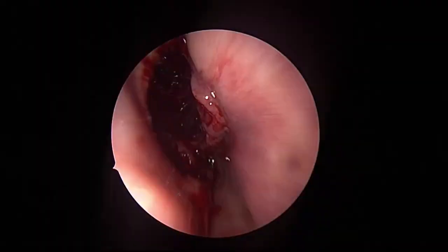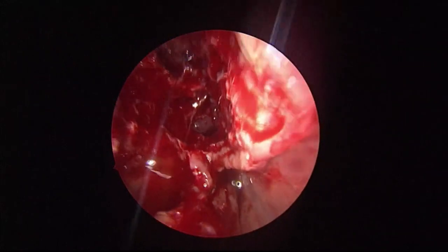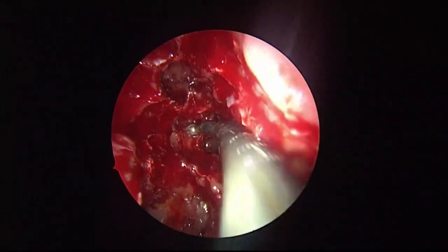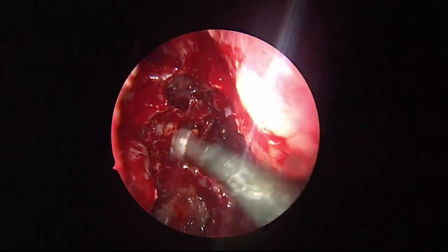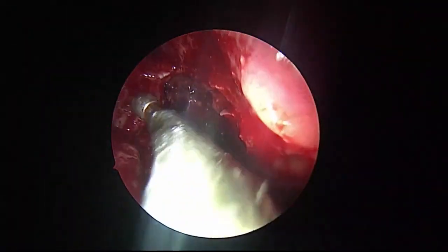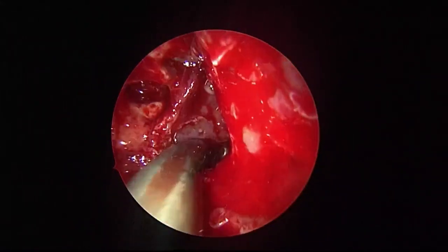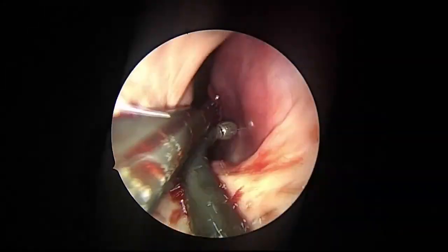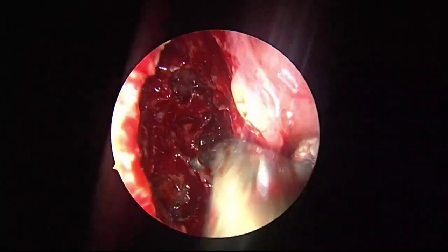Give me wash. We'll see with the 70-degree again, everything. Then we'll use our hydrodebrider for any debris left behind. Looks clear. What about the middle turbinate cross sections?